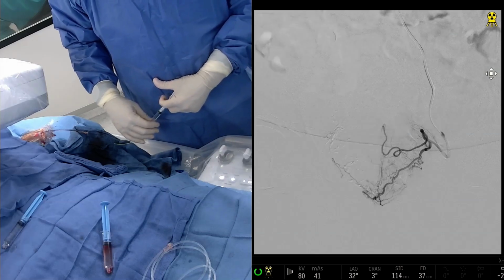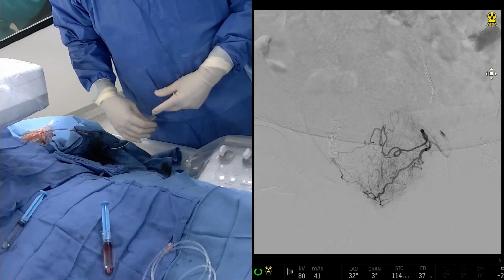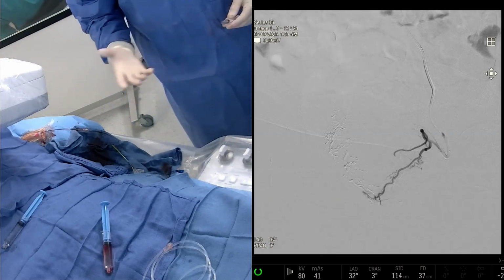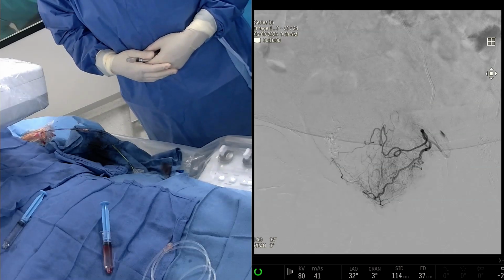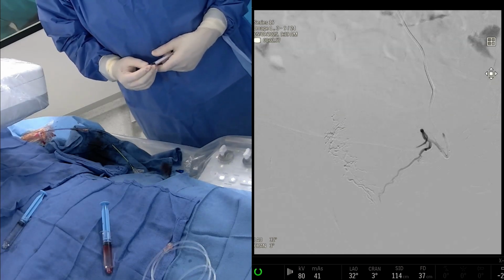Yeah, that's what we suspected. So we're filling even the part of the tissue on the right side that we didn't embolize. Some patients, as you guys know, will have the majority of their supply, sometimes 2/3, from one artery. But both of these arteries are very clearly going to the prostate. I don't think there's any doubt about that.